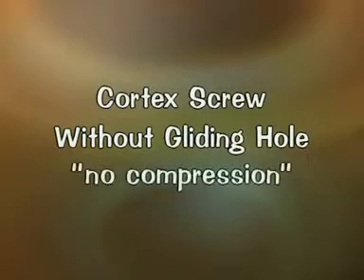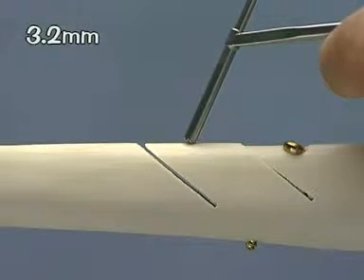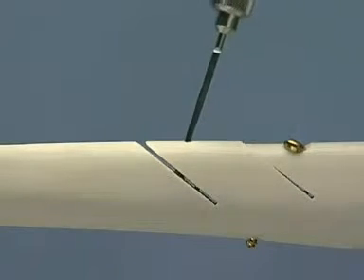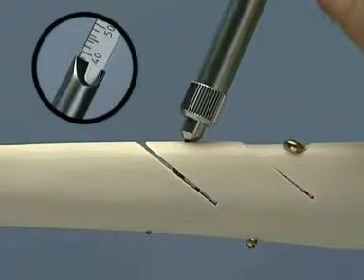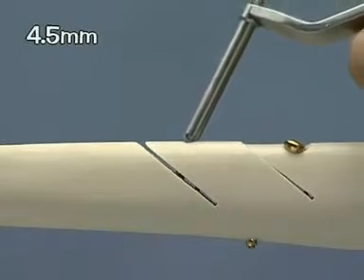Now the cortex screw is demonstrated without a gliding hole, which does not provide compression. A hole is drilled with the 3.2 mm drill bit and drill sleeve through both cortices. The depth is measured. Tapping with the 4.5 mm tap and sleeve.